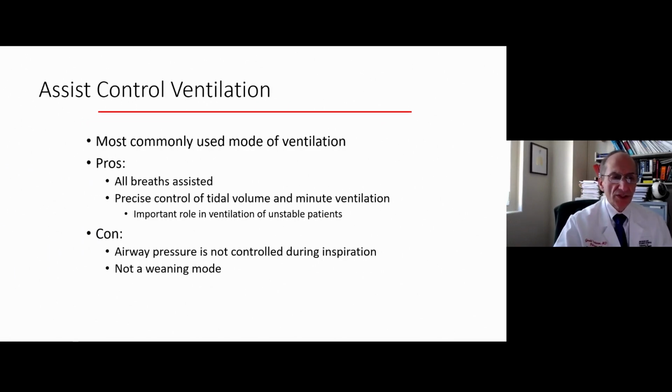So very briefly, assist control ventilation, it's really the most commonly used mode worldwide. All breaths are assisted, whether the patient initiates it or otherwise. It gives precise control of tidal volume and minute ventilation. It gives us a guaranteed minute ventilation, which is really critical. For example, when somebody is first acutely ill and maybe first intubated and under the influence of sedatives or the medications used to intubate, or patients coming out of the operating room. So assist control is used so broadly, it is the most common mode of ventilation.